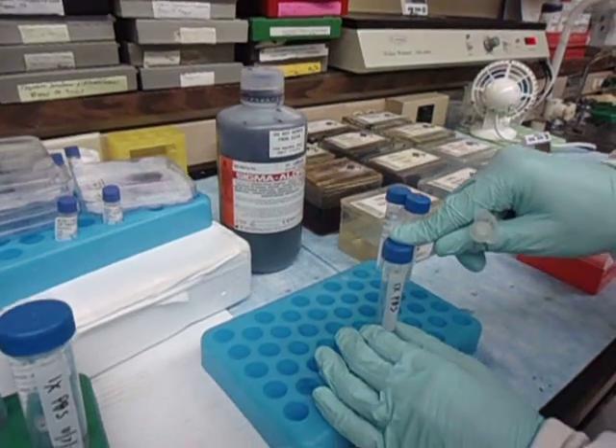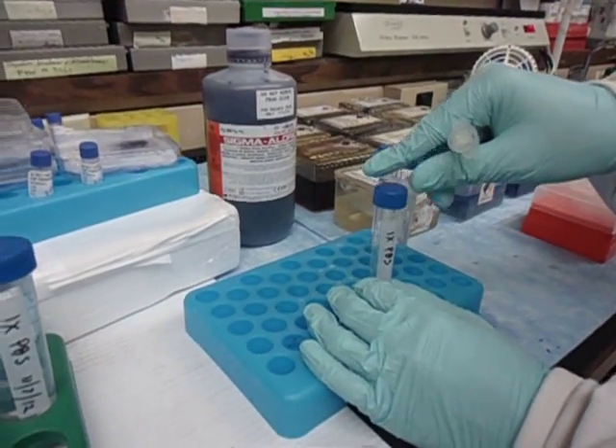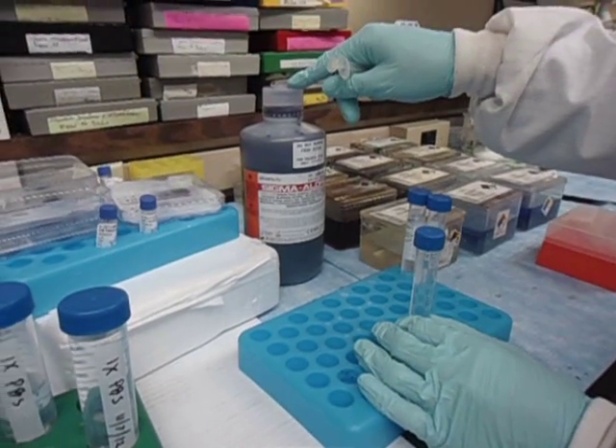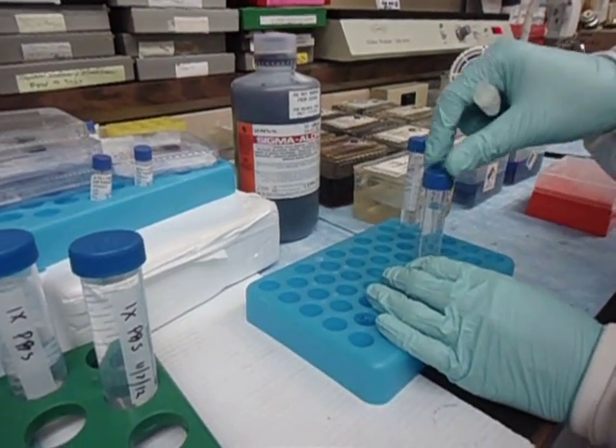We've aliquoted our buffer into smaller vials and this is 12.5 milliliters. We'll be putting 0.5 ml of the Sigma-Aldrich Giemsa stain in order to produce a 4% solution.